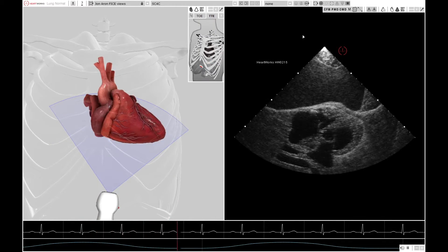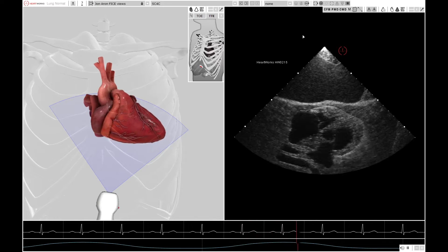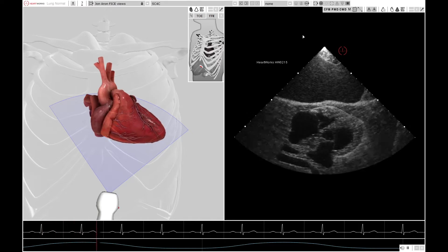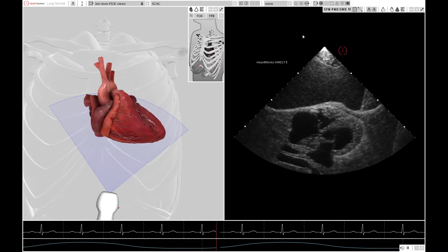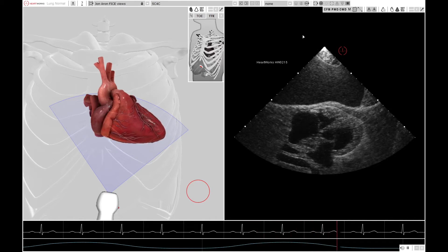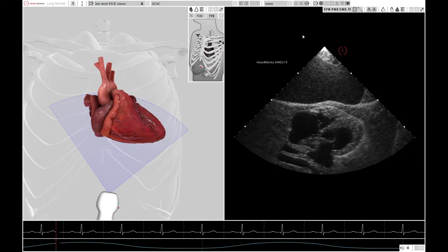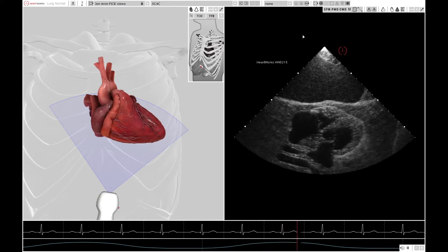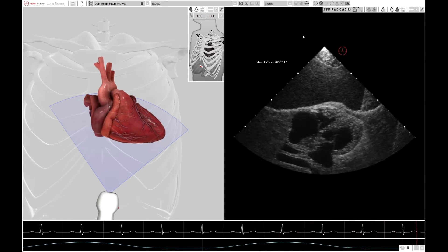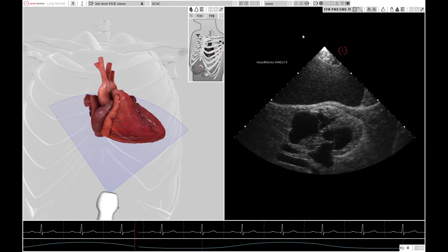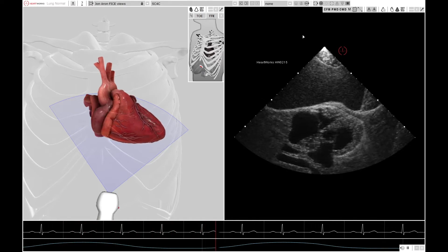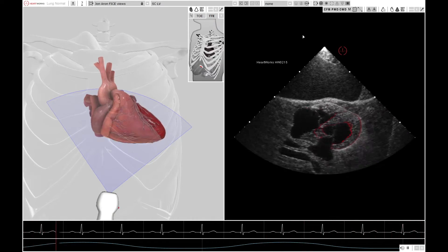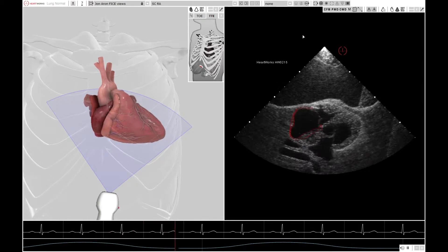The final window is the subcostal window. You get an image of the heart by scanning through the liver, which is a very good acoustic window. You get a four-chamber view if the pointer is pointed towards around three o'clock, towards the left of the patient. To get this image you often have to increase the depth and push quite hard, which is uncomfortable for awake patients. In the context of cardiac arrest, this should be the first view you try to get, as it's often the easiest and most useful. The structures visible are a triangular-shaped right ventricle, a left ventricle, a right atrium, and a left atrium.